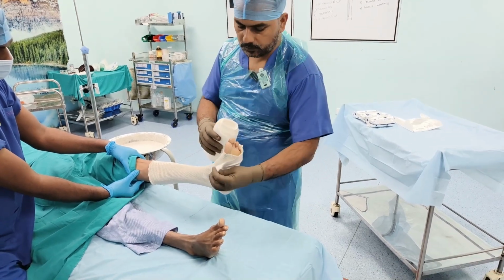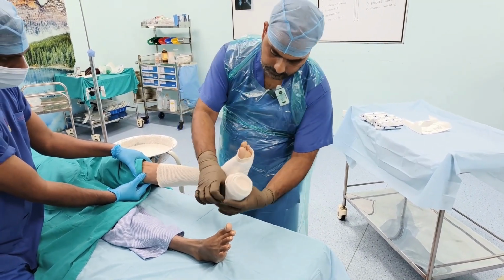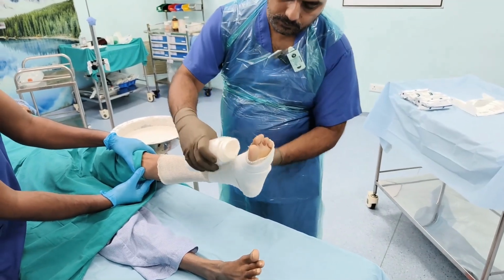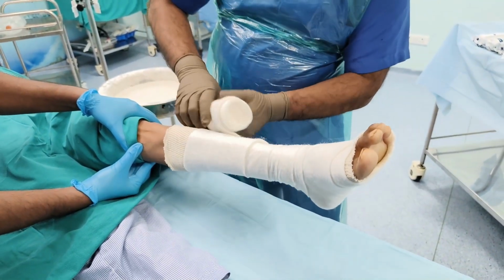The next step is to apply the cast padding. You start at the foot and then proceed proximally. A simple trick is that whenever you are wrapping, you have to cover the upper 2/3 of the previous wrap, and that is how you proceed.